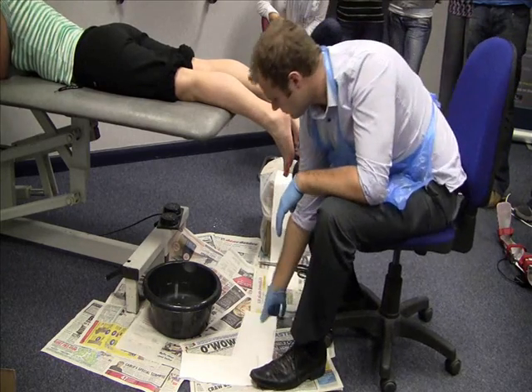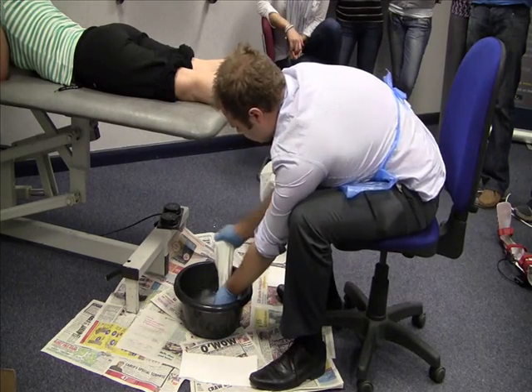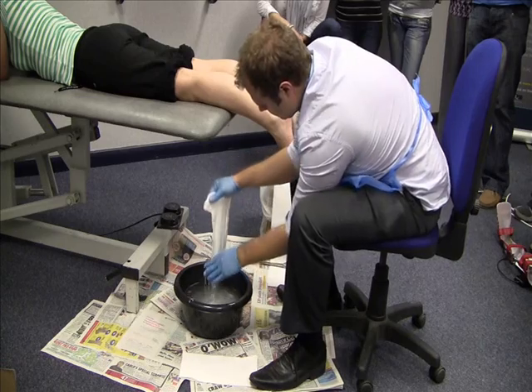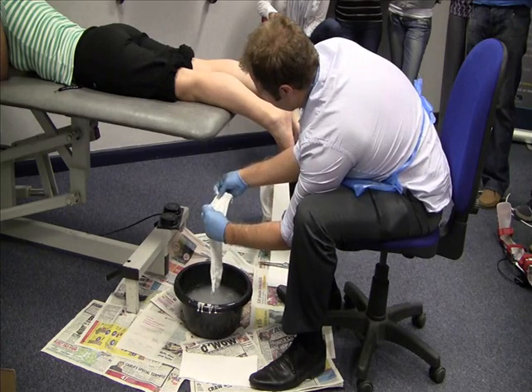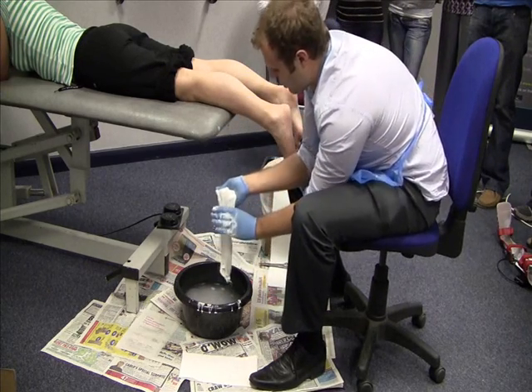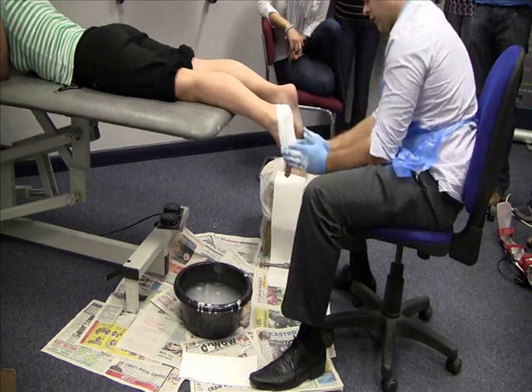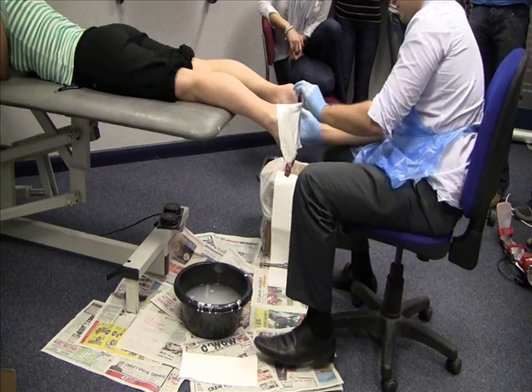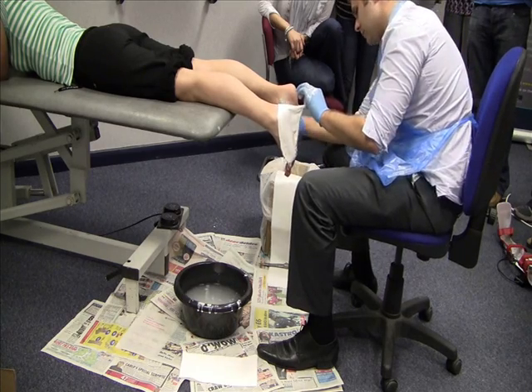Start with the top piece. Submerge it in the water. Bring it out and smooth down all the plaster. Fold over an edge for when you remove the cast. This is quite a weak and flimsy plaster. Drape over the foot and pull out from the heel. This enables you to smooth down the medial side first, making sure that you get rid of all lumps and bumps.